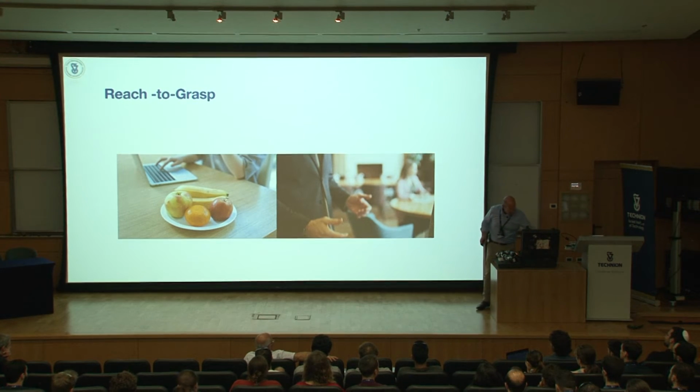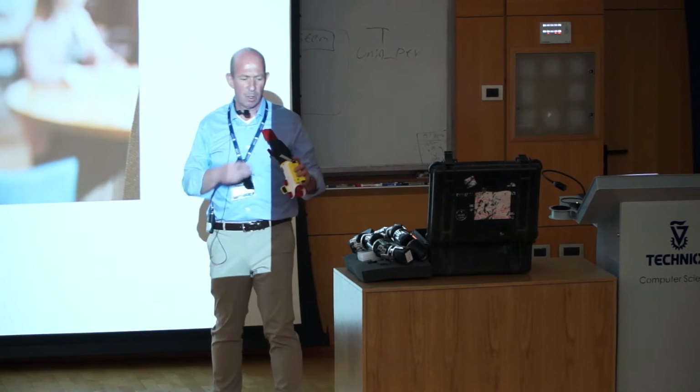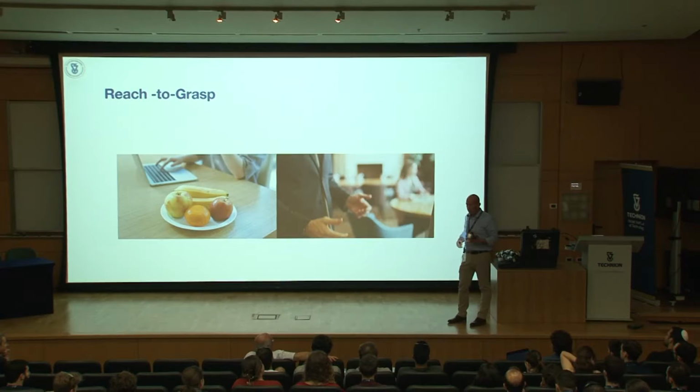So when you have a prosthetic hand that looks like this for the children, by the way, you can choose any color you want, logos of football, everything. That's the fun part. It bears a psychological burden on the operator to reach, open the hand, orient it, close it, things that we do automatically.